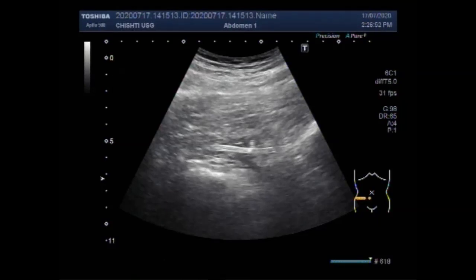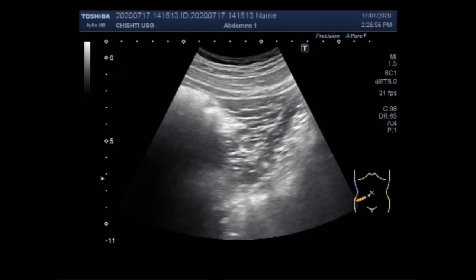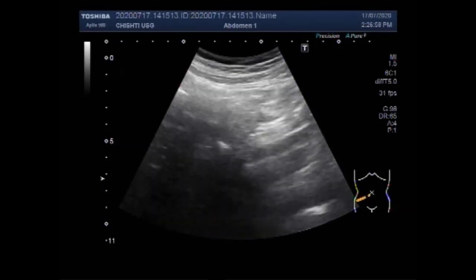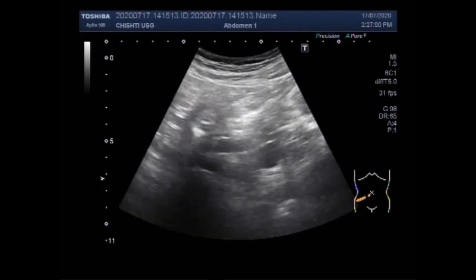Dear viewers, I hope you are all fine. This ultrasound video shows a tapeworm in the abdominal cavity — a rare finding.